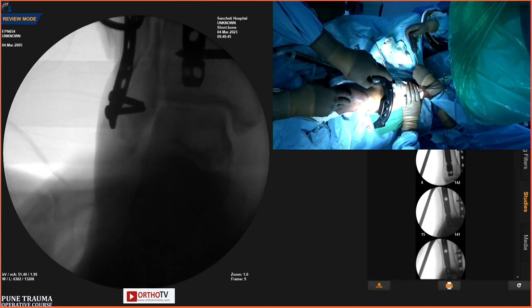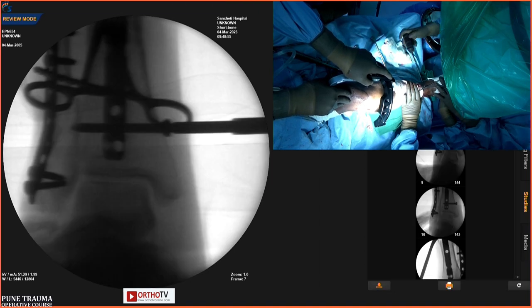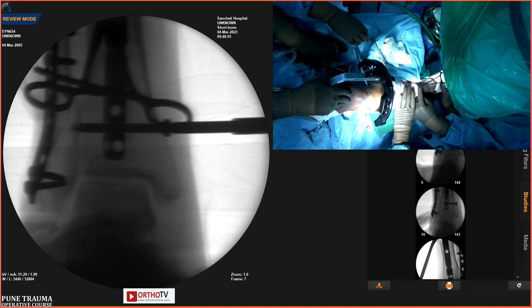We'll break fixation for 5 minutes. We'll come back to you again because Jignesh has to present his case. I plan the frame in a way that if need be, if there is resorption of the comminuted fragments, I'm able to do a corticotomy down the line.